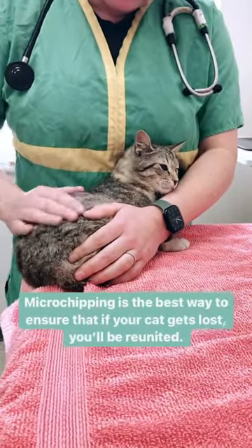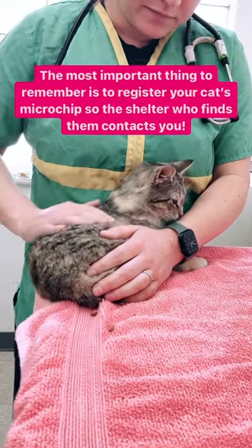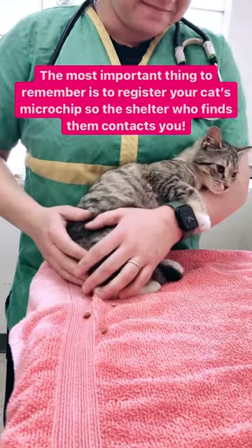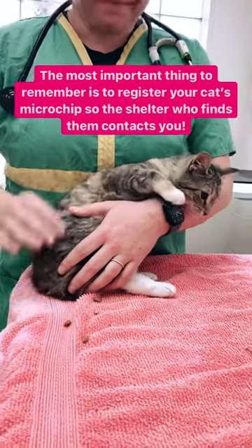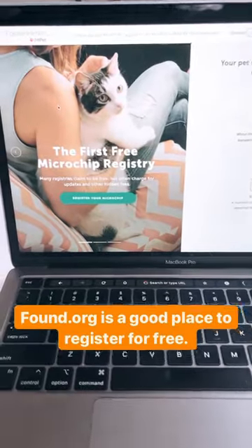Microchipping is the best way to ensure that if your cat gets lost, you'll be reunited. The most important thing to remember is to register your cat's microchip so the shelter who finds them contacts you. Found.org is a good place to register for free.